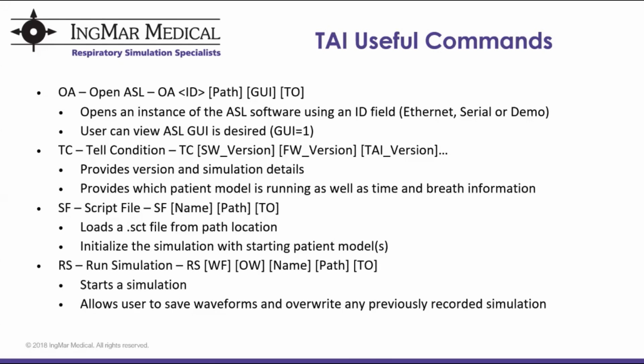The RS, or run simulation command, is used to name the output file for the simulation, determine whether to overwrite an existing output file, and to define whether or not to save the waveforms. Please note that saving waveforms can result in quite a large output data file set.